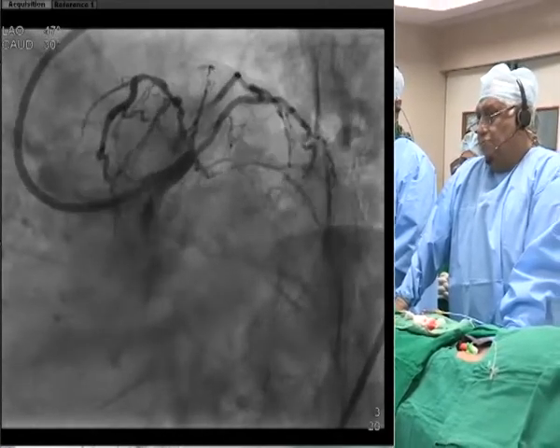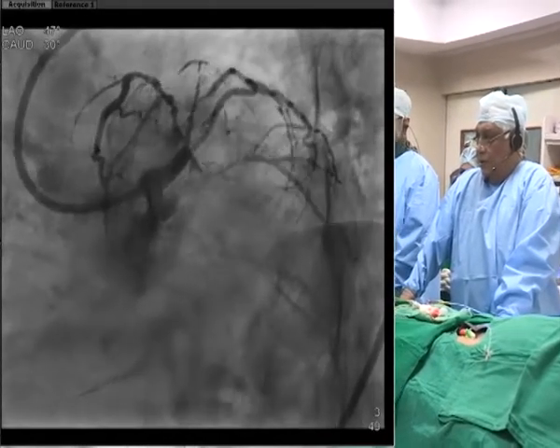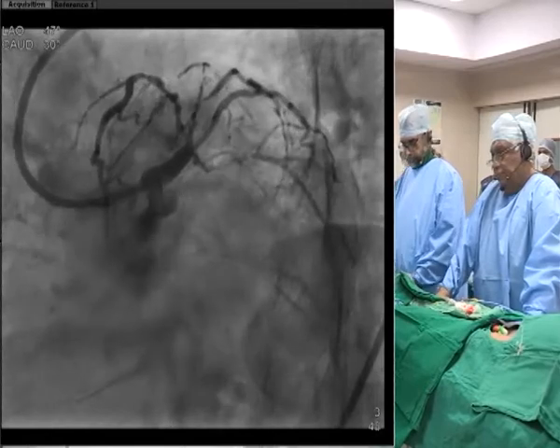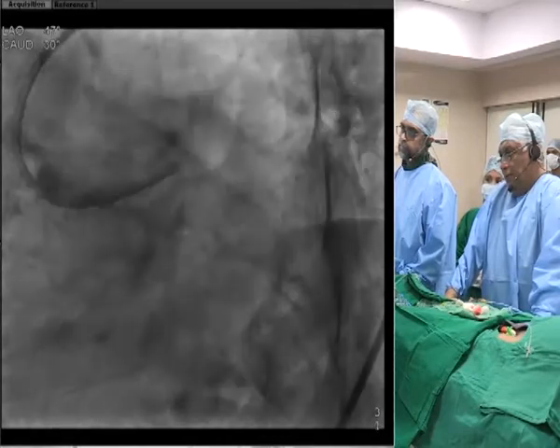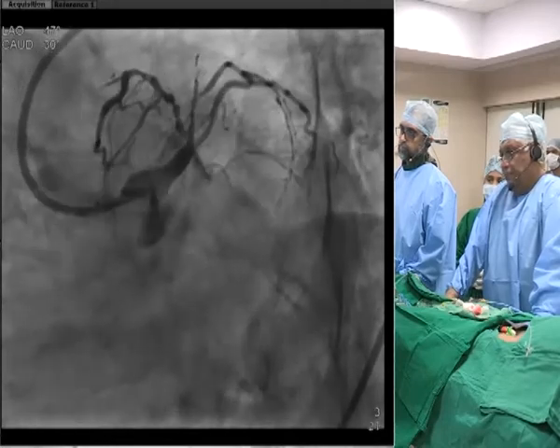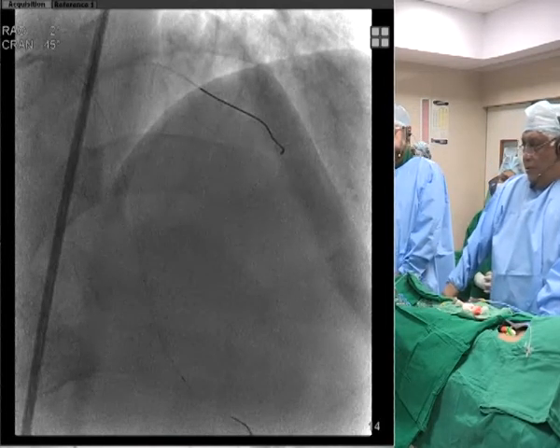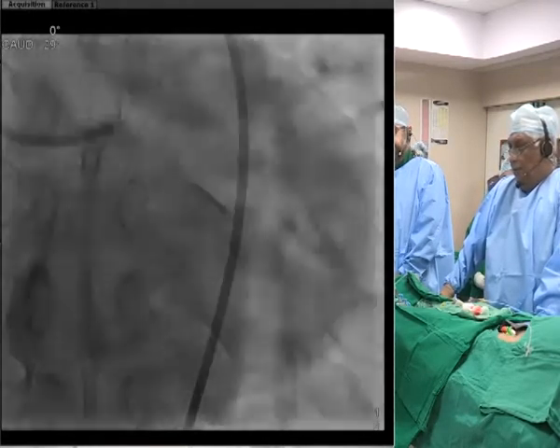I think the key thing for him, in his 50s, is to do the most complete revascularization possible with current generation DES and treat his LAD, treat that intermediate diagonal and the circumflex. In what manner and fashion you do it is irrelevant, but clearly the culprit is the LAD diagonal system, which should be tackled. And the circumflex seems like there's a channel and could be stented as well without compromising the ramus or the left main. So that's what I would do. And let's see what your plans are.